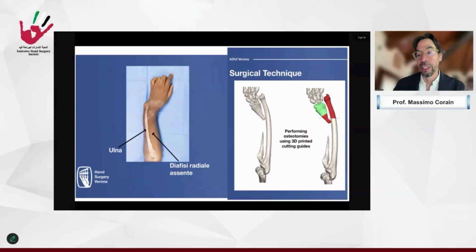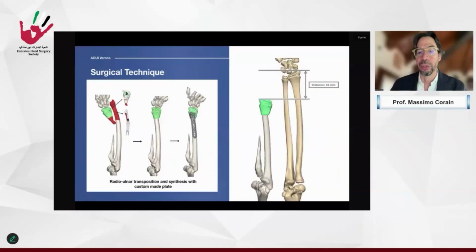in order to have an easy realignment, keeping the flexion extension wrist motion, without applying a lot of force to strike the soft tissues. So this is the planning of the transfer with a custom-made plate because the distal part is very small, and in this case I can have 4 screws, so a stable synthesis.